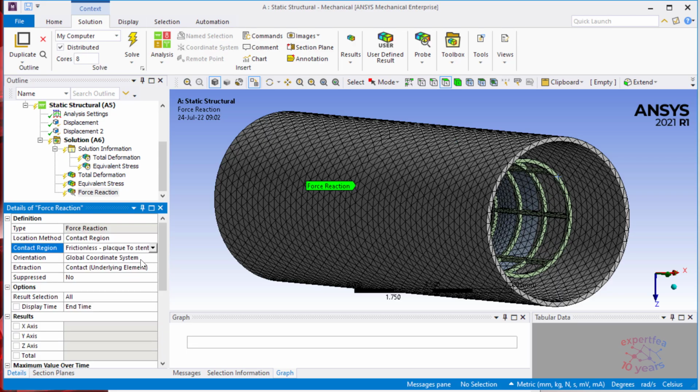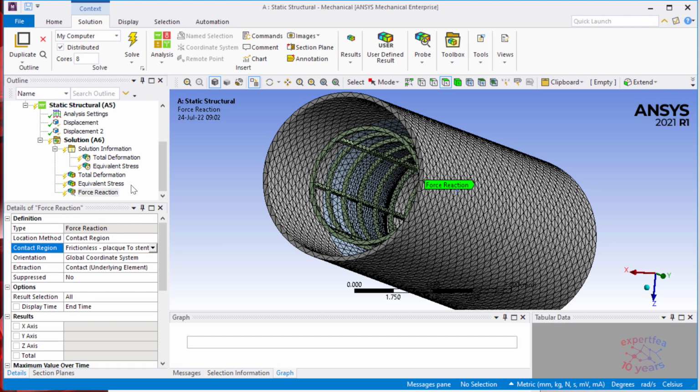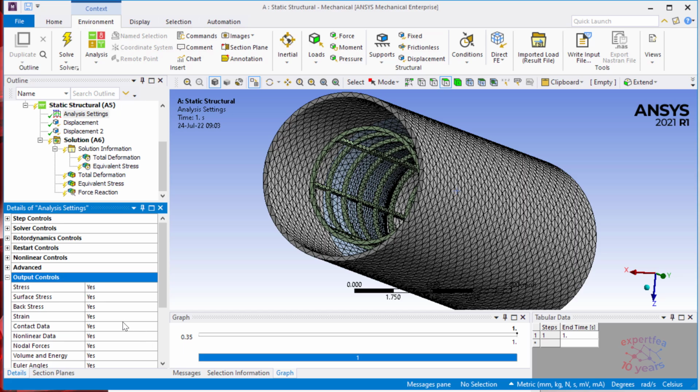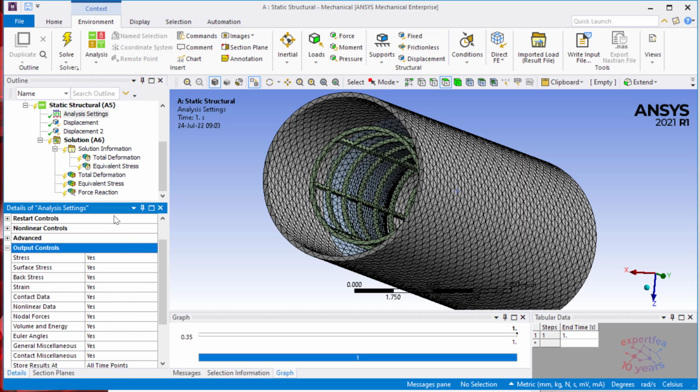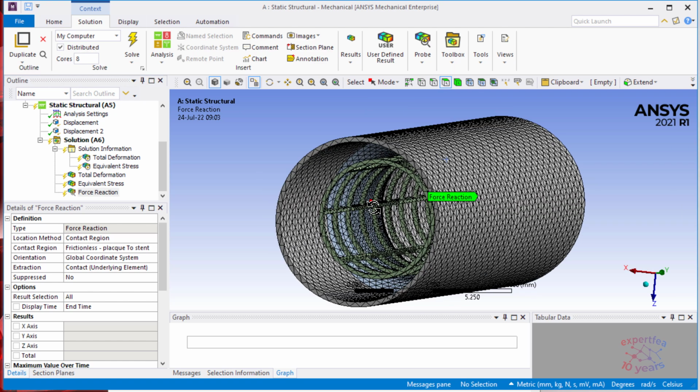I'm talking about between plaque and stent. Yes. If we were not to make here everything, we could have not chosen, or we couldn't find out the force reaction in the contact region.